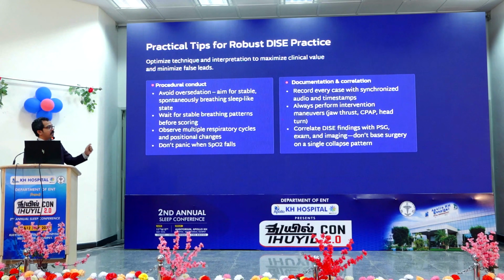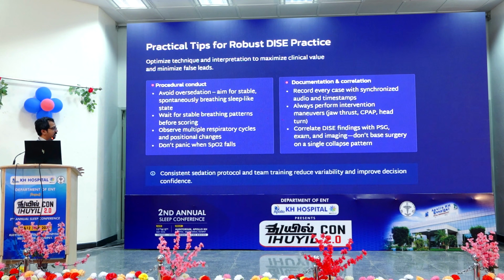And documentation. Record every case. Always perform interventional maneuvers when you are doing a DISE. Correlate with the PSG findings. And be careful when you do a pediatric DISE, because in kids saturation fall can happen fast.